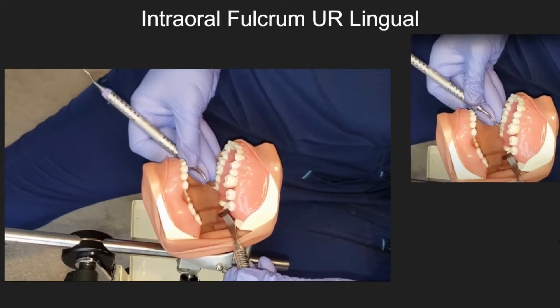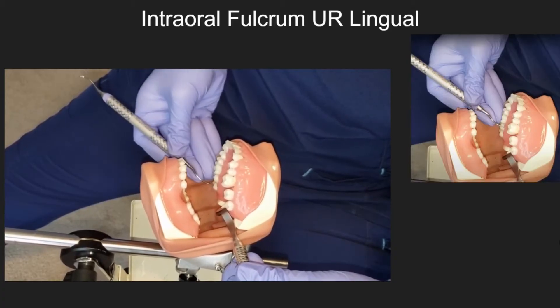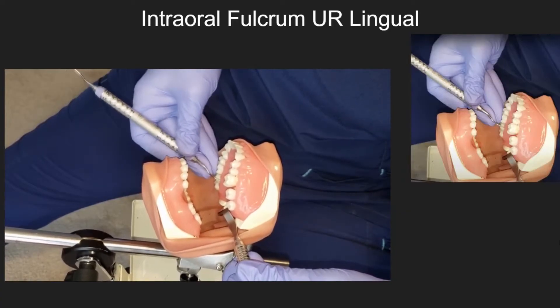Intraoral fulcrum — upper right lingual. Notice how the clinician maintains the modified pen grasp while fulcruming on the buccal cusps of the posterior teeth.